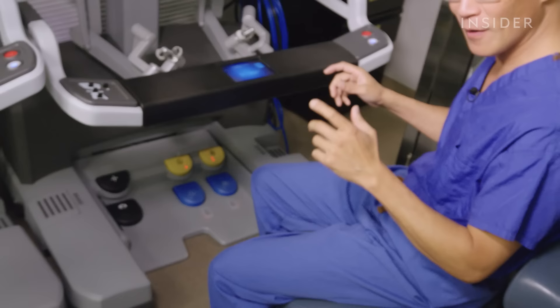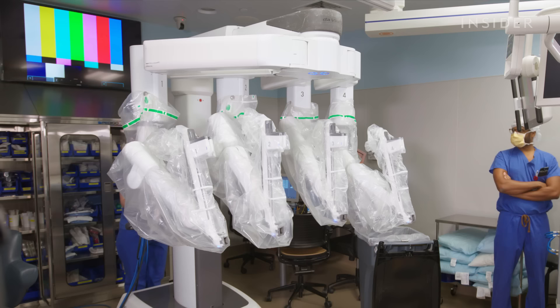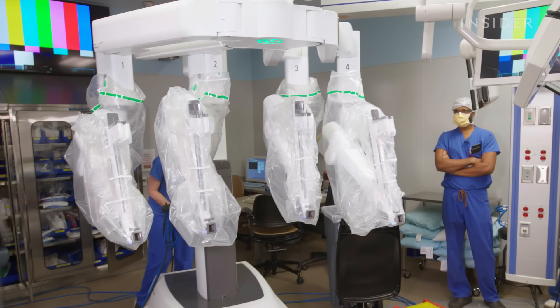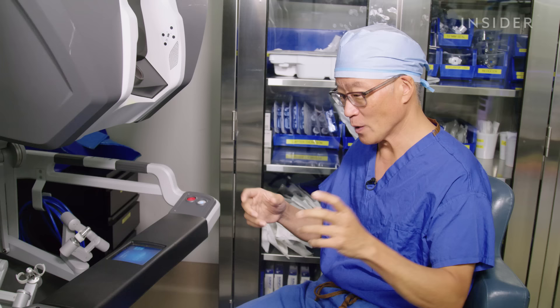The pedals are used to help manipulate the left arm, the right arm, to move the camera closer and further, and allow you to manipulate in three-dimensional space. It's obviously a very complex instrument — the robot has multiple arms that we need to be able to manage. We only have two hands but we have four arms, so we can switch from arm to arm by utilizing the different pedals at our disposal on the console.